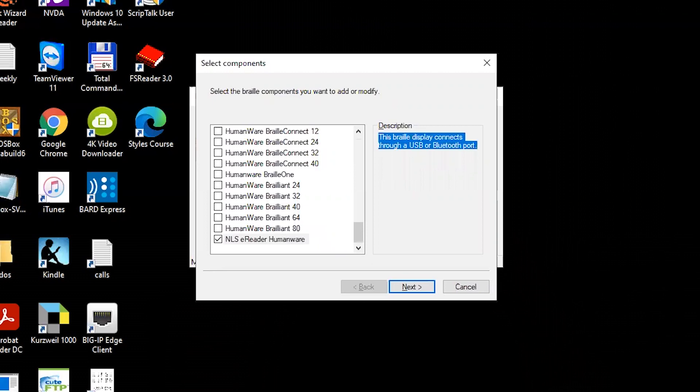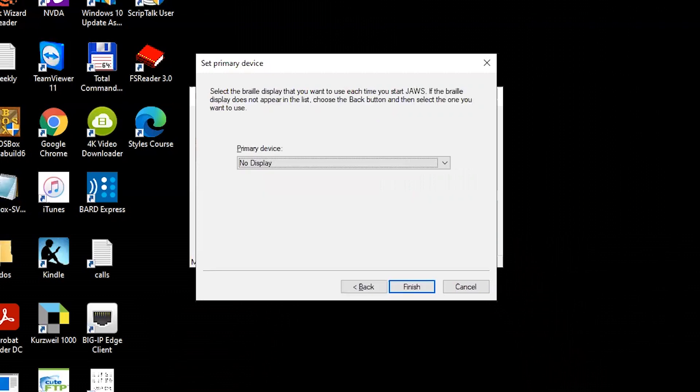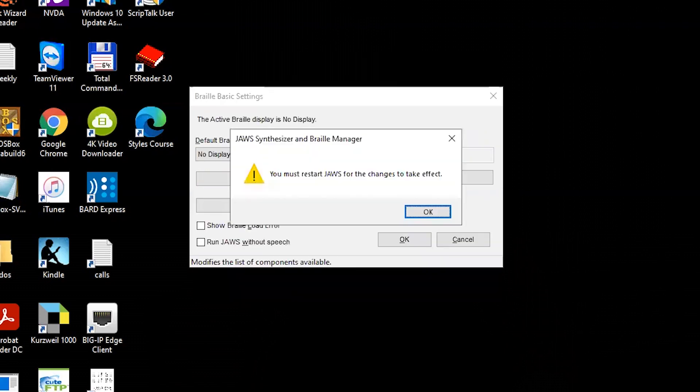Tab to Next and press the Enter key. Next, you will be asked to select the output port for the NLS eReader HumanWare Braille display. Select USB, tab to Next and press Enter. Next, you will be asked to select the Braille display that you want to use each time the computer starts. Arrow to NLS eReader HumanWare and tab to Finish. Press Enter on Finish.